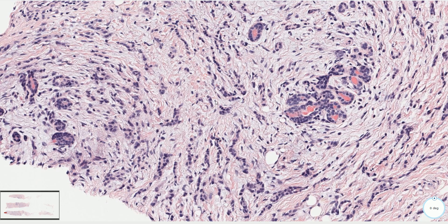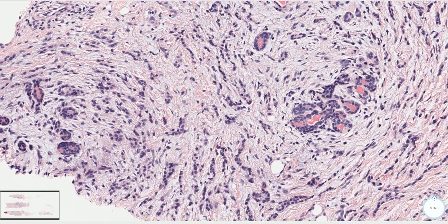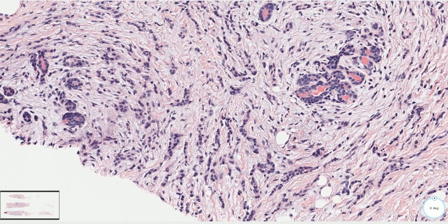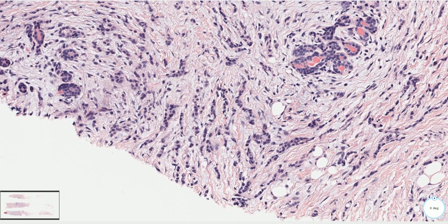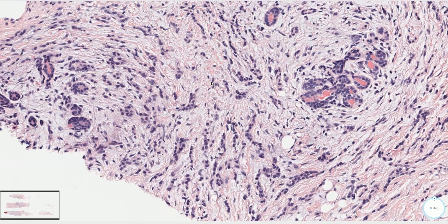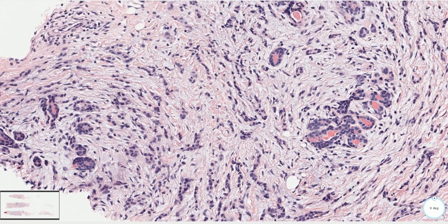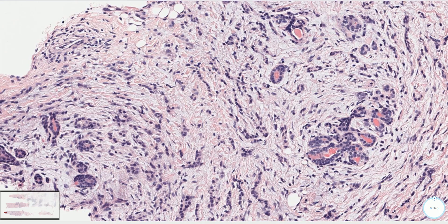In lobular carcinoma, the typical single-file pattern morphology can be explained by loss of cellular adhesion molecules. These cells do not stick together anymore and they spread in between the collagen fibers where there is no resistance or lower resistance. The reason for similar morphology in tubulolobular carcinoma is not very clear.